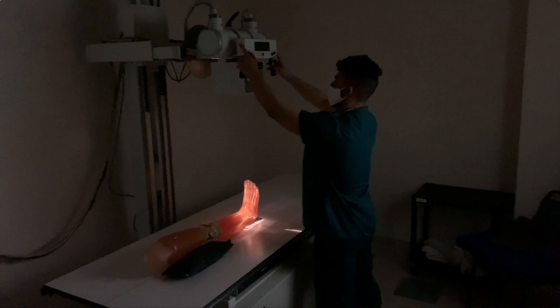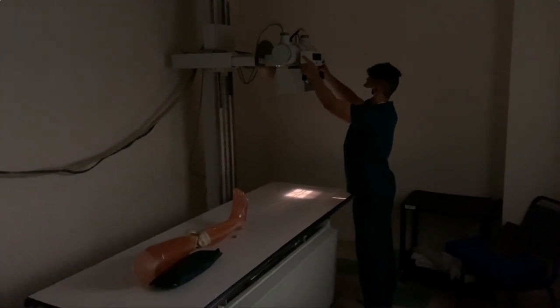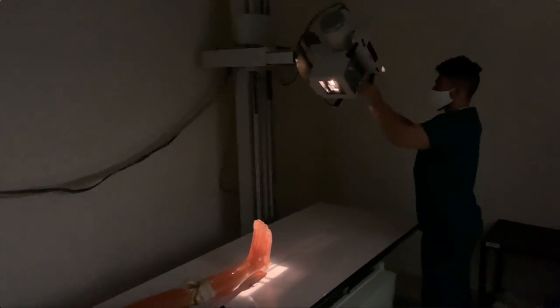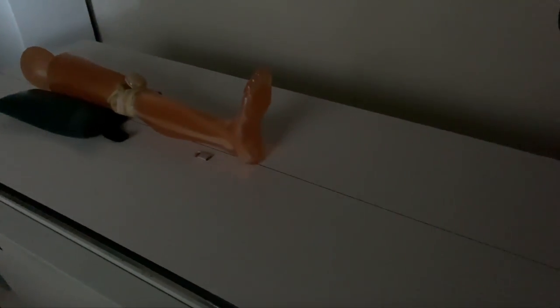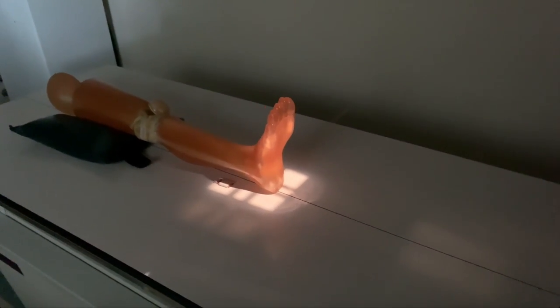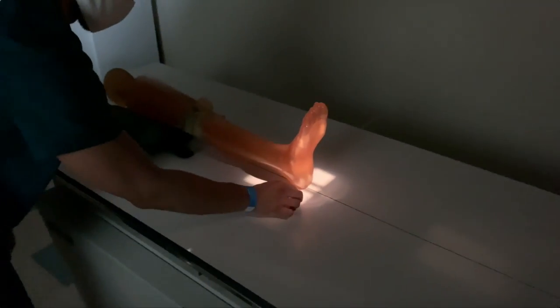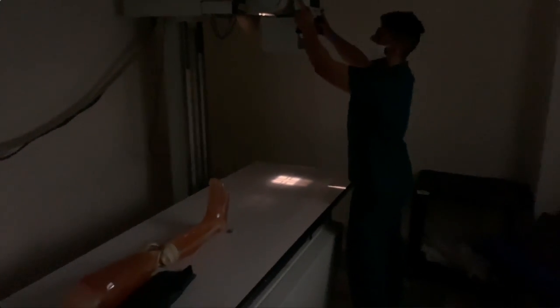For the plantar dorsal axial projection of the calcaneus, you want to make sure your SID is 40 inches, the cassette size is 8 by 10 inches, and 70 kVp. In this case, since I'm using the IR that is placed under the tabletop, all I need to do is center the calcaneus in the middle and collimate. The patient must be supine and they will have to dorsiflex their foot. The CR will be at the base of the third metatarsal and angled 40 degrees cephalad from the long axis of the foot. You want to make sure your CR is also aligned with the IR before you take the image.